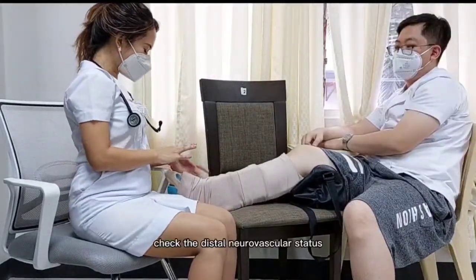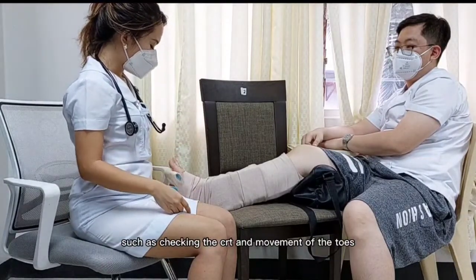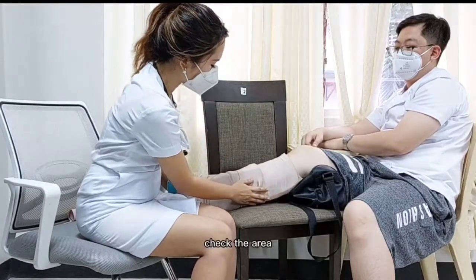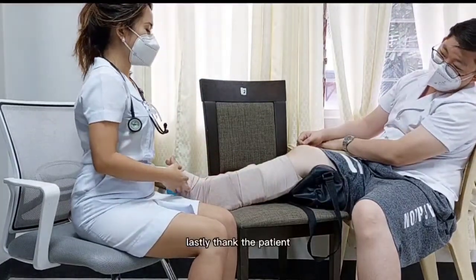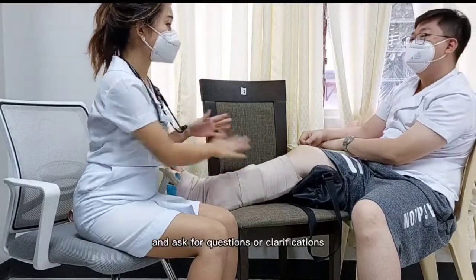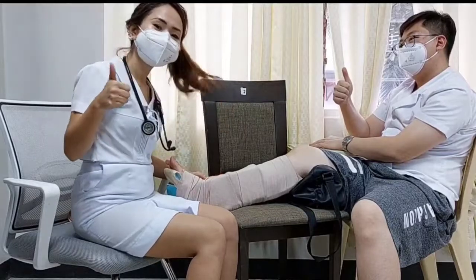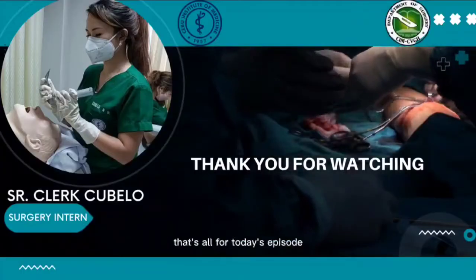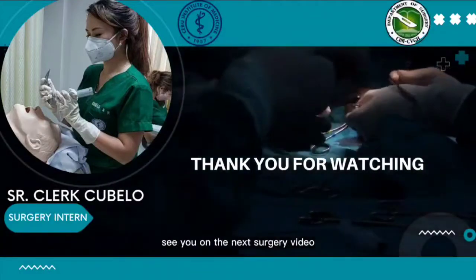Check the distal neurovascular status, such as checking the CRT and movement of the toes. Check the area and make sure that there are no rough edges. Lastly, thank the patient and ask for questions or clarifications. That's all for today's episode — hope you learned a lot. See you on the next surgery video.